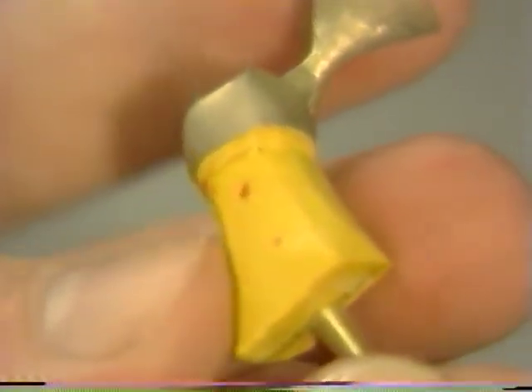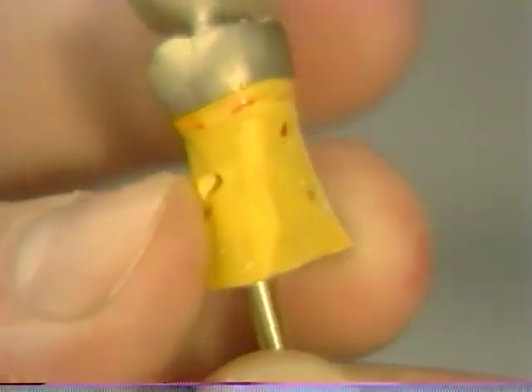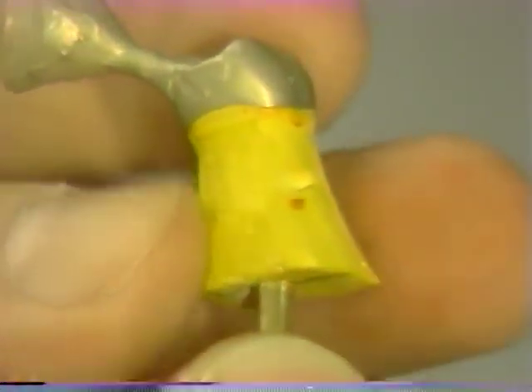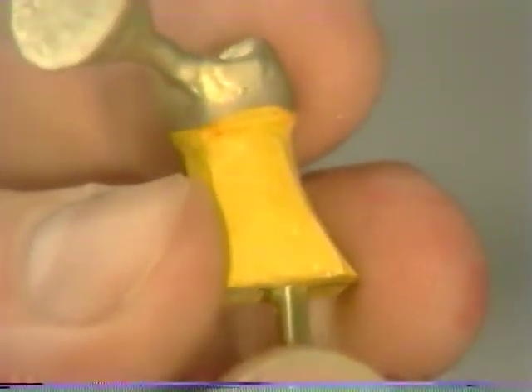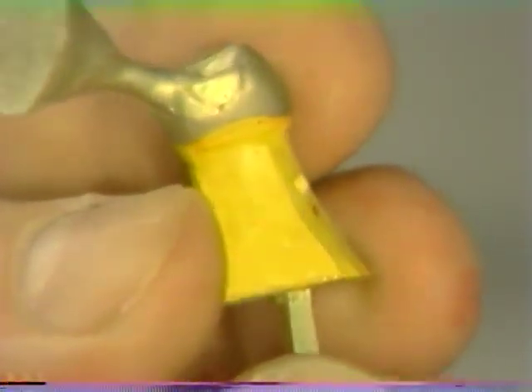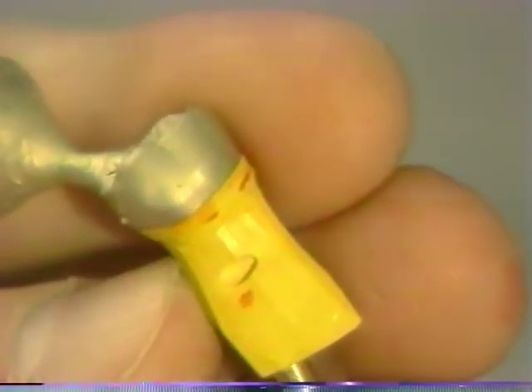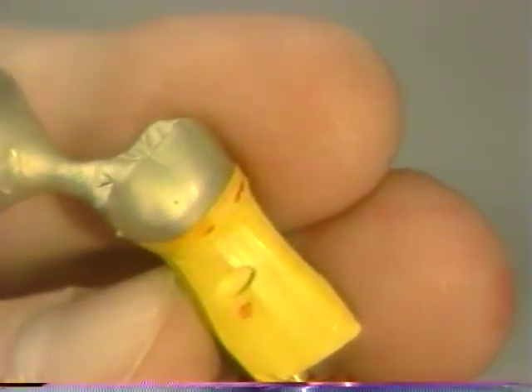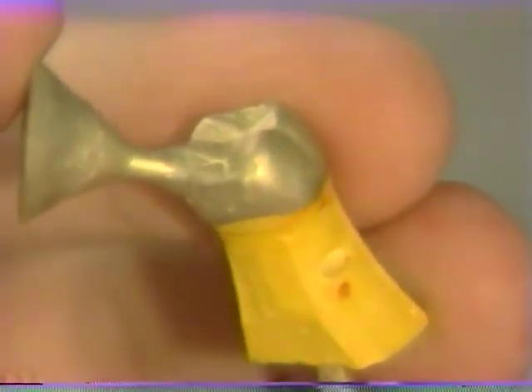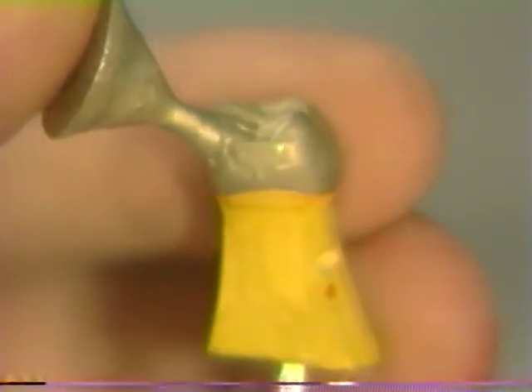Circumferentially, no shadow line should be visible. If a gap is present, either the casting is not fully seated or perhaps the pattern was warped at the wax-up stage and the procedure needs to be repeated. Once satisfied that the fit is acceptable, the button can be removed and we are ready to proceed through the rubber wheel stage.